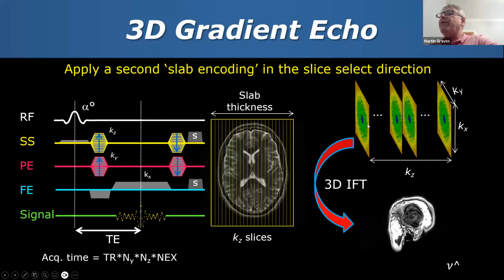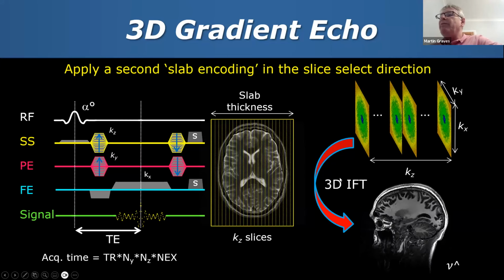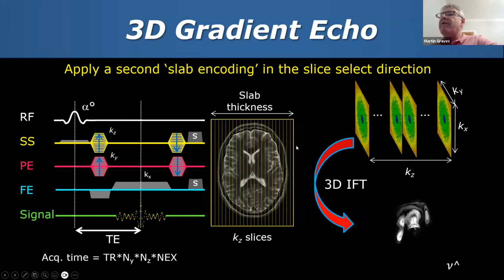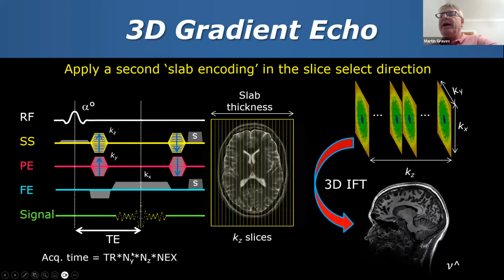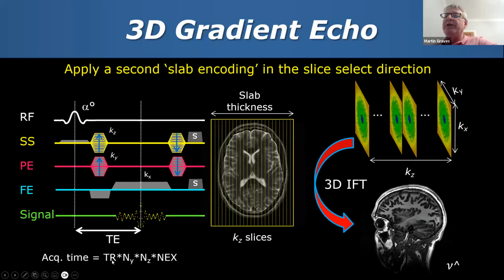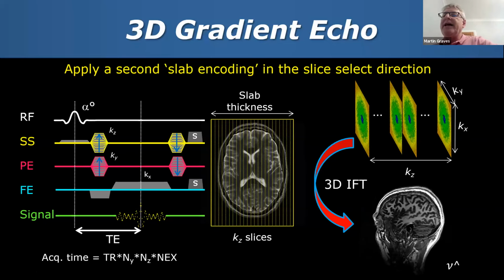So following a three-dimensional Fourier transformation from there, we end up with images like this, just cycling through this gradient echo series with relatively thin slices here, because we have the benefit of a very thick excitation and doing these multiple KZs. So even though the acquisition time is going to be longer, the advantage with gradient echo is we can have a very short TR, it does mean that we end up with these three-dimensional data.